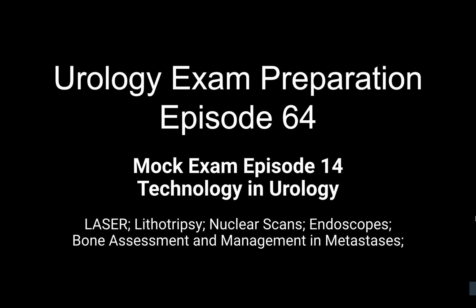So in my practice, we do a bone scan with technetium methylene diphosphonate, technetium MDP, to assess for the bone metastasis. Okay, how does it work?